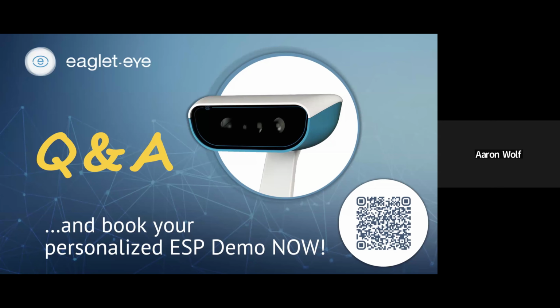Outside of that, you can do other metrics. It's an anterior surface imaging device, so you won't be able to do posterior corneal or posterior elevation metrics. But there is another metric. Obviously, we know about K-max. That's a very common one. You can figure out K-max on your own. But there is a central K, which is basically smack dab in the middle of the cornea, which is different than average K, and different than max K. Your central K, anything over 47.2 is abnormal, and anything over 48 is considered keratoconus.